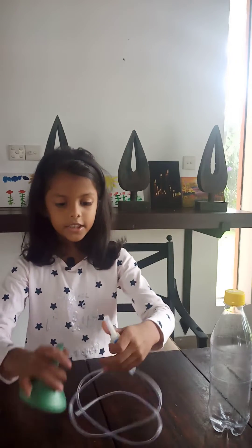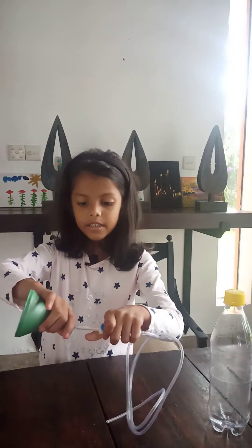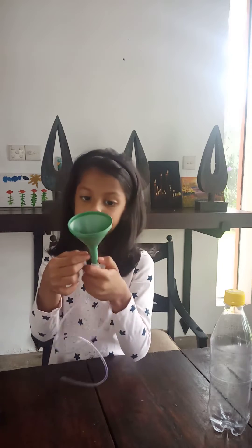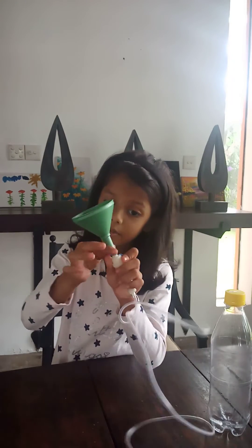Anyway, first stick the tube into the funnel. If it's loose, tie a bit of string right around here.